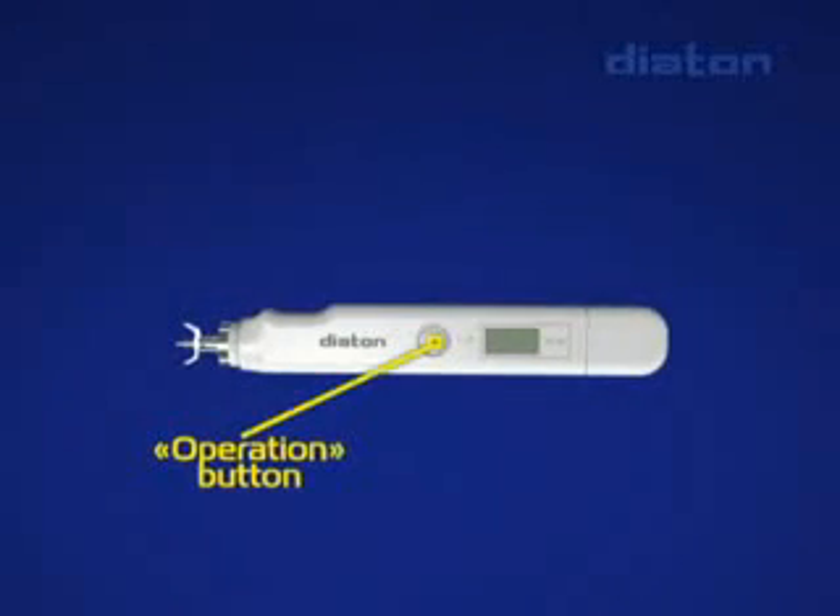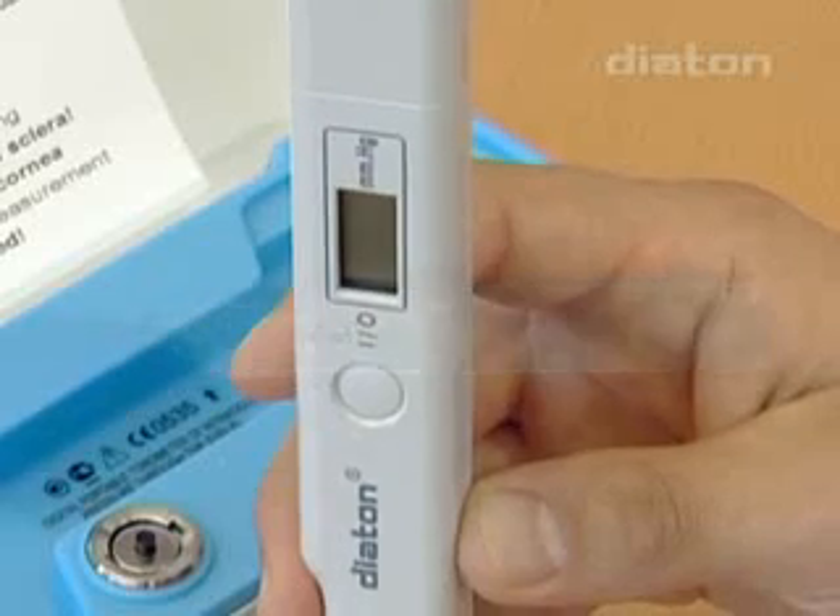The operation button controls the tonometer's operating modes, including turning on and off.